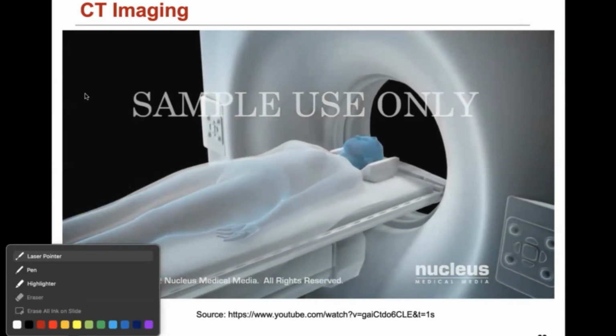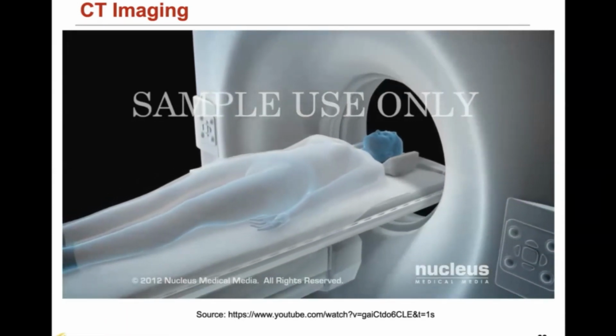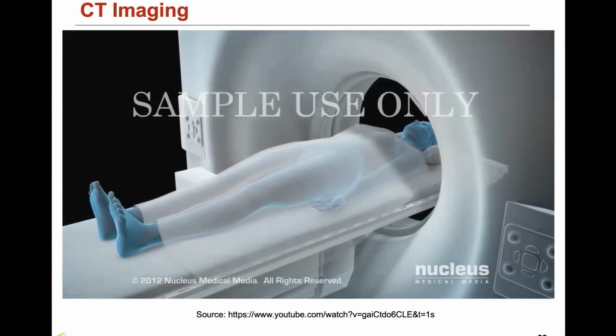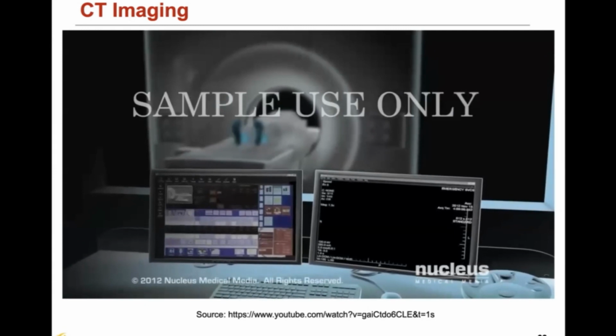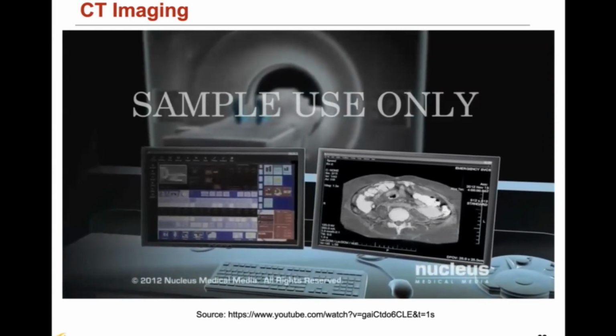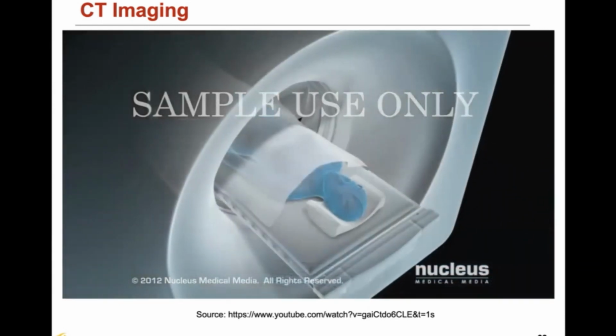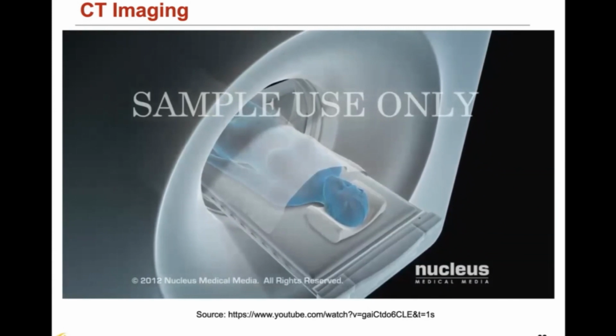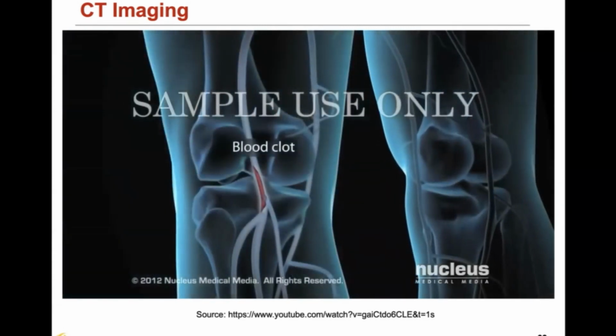A CT scan, also known as a CAT scan or computerized axial tomography, is a painless diagnostic test that uses X-rays and computers to create cross-sectional images of bones and tissues inside your body.